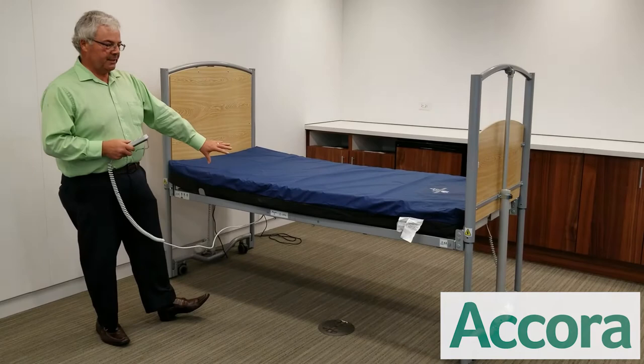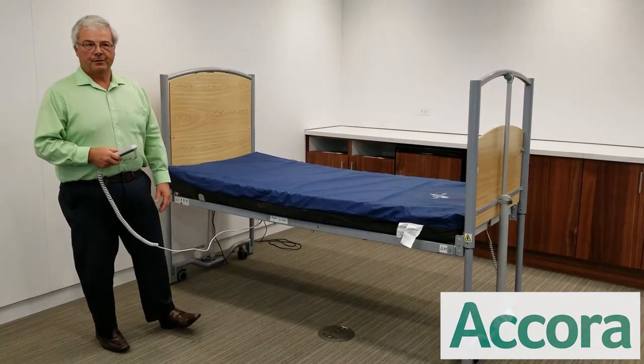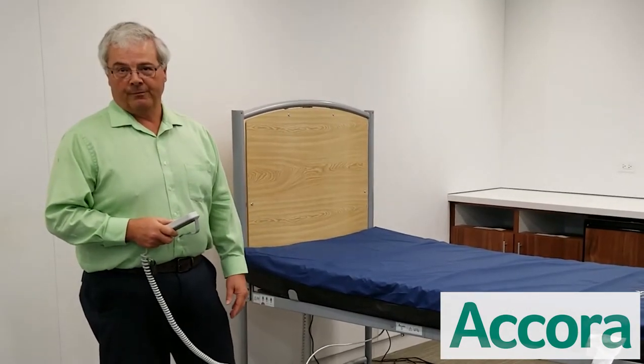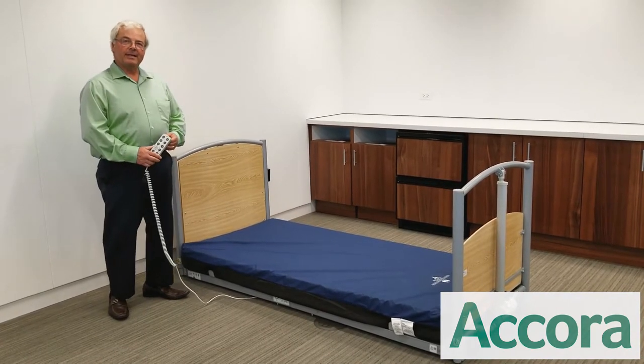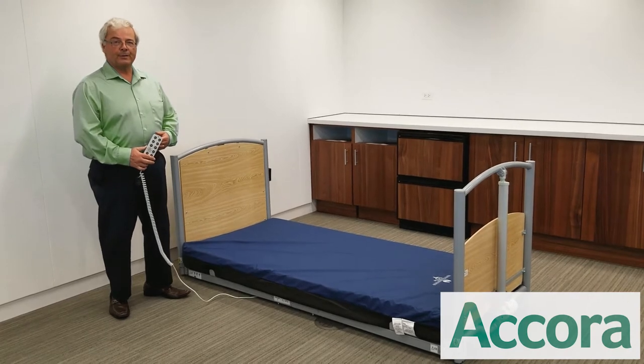This is a 36-inch model. We also have a 42-inch model. The 36-inch will hold 330-pound patient weight and the 42-inch will hold 500 pounds. The floor bed is fully compliant with the latest safe patient handling anti-entrapment code 60601-2-52.